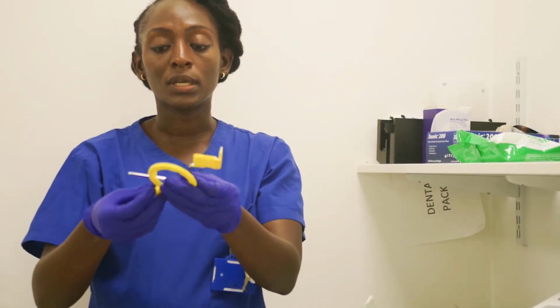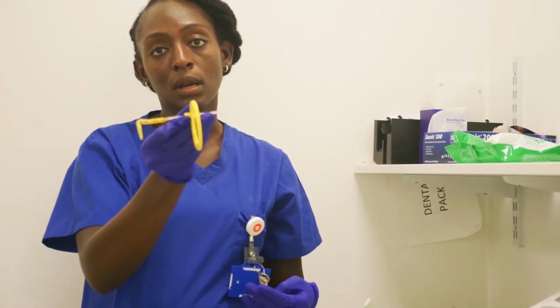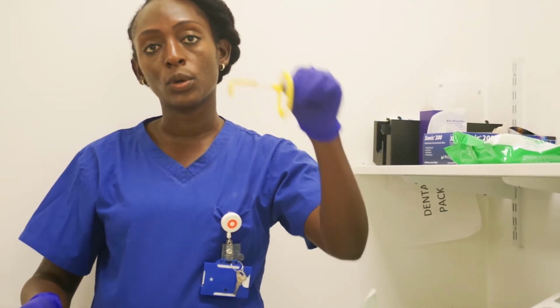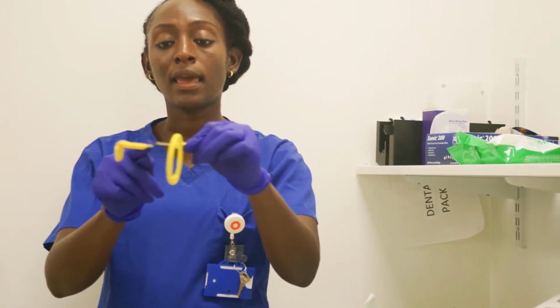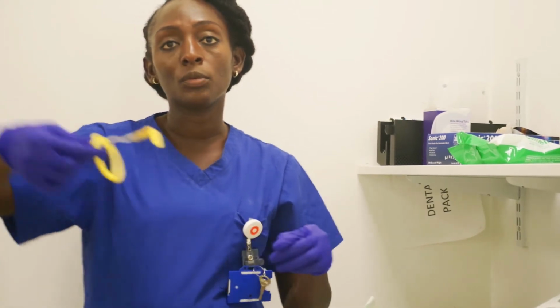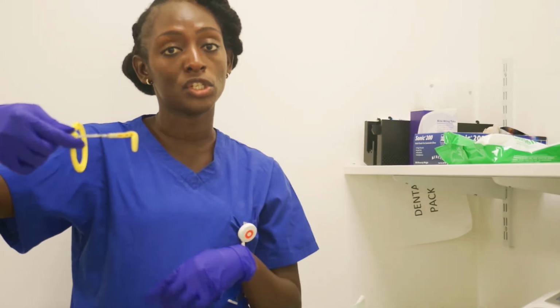Okay, so I'm going to assemble it right again. And this is what you'd want the setup to look like. So this would be for the lower right 6, so it will be for the patient's right. Remember that when you're taking whichever quadrant, this curve should stick out of the mouth. So this assembly cannot be used for the left hand side because this will be in the way of the cheek. Okay?